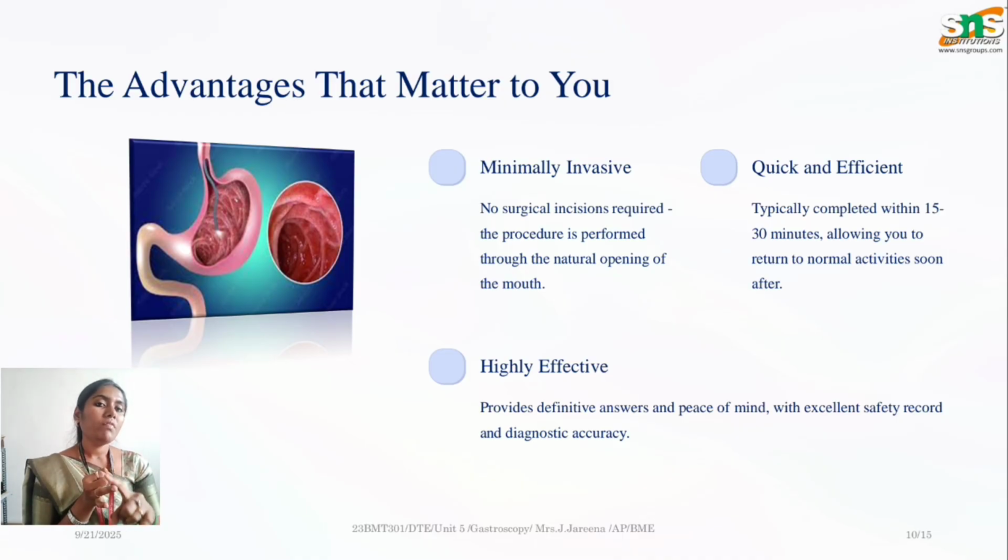If we start the treatment on the same day, at an early stage, the survival rate and recovery rate of the person is very high. Even 1 minute matters a lot in medicine. So gastroscopy gives very quick analysis of the problem and efficient treatment, and it is highly effective compared to other traditional technologies.